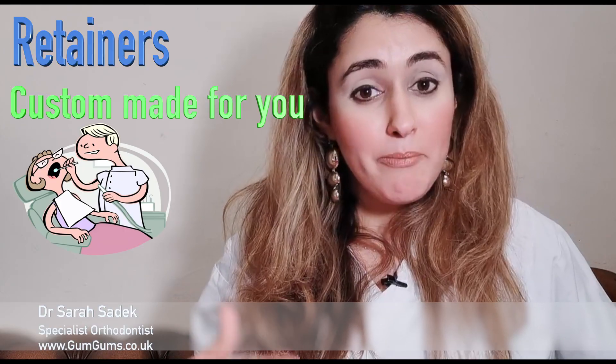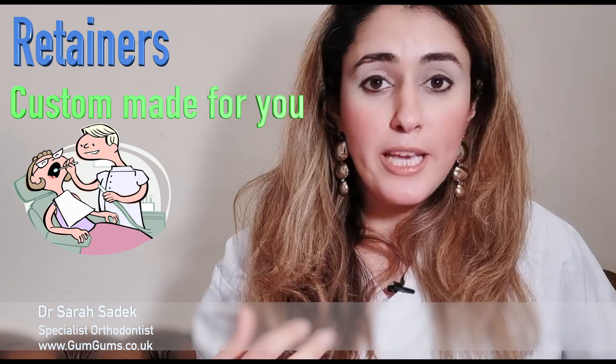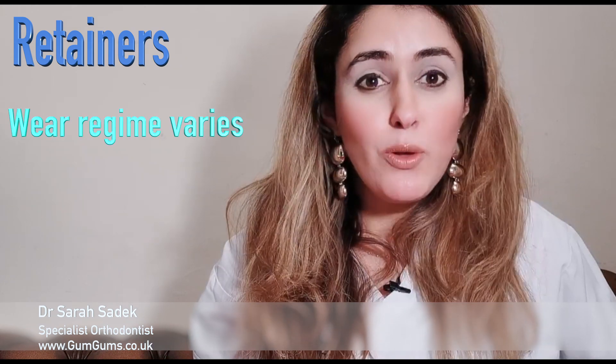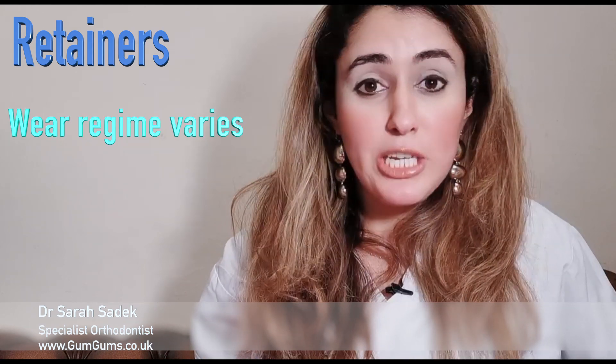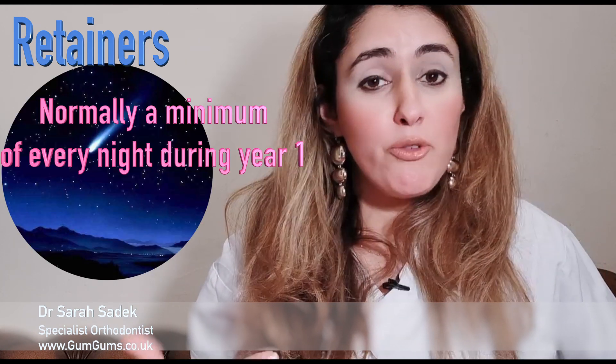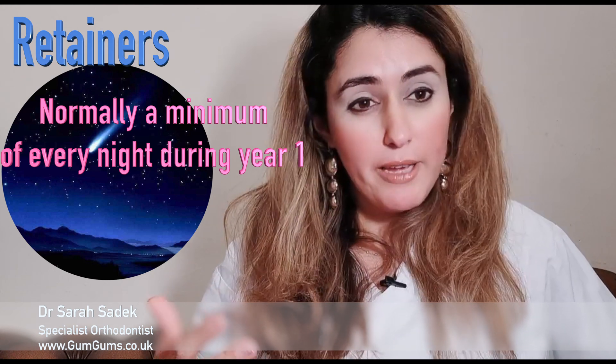Both of these retainers are custom made for you. After your treatment, your orthodontist will scan or take molds of your teeth to make them, and they will fit your teeth perfectly. Your orthodontist will then advise you on the wear regime for you, which can vary, but there will normally be a minimum of wearing them every night for the first year, followed by two to three nights per week for life.